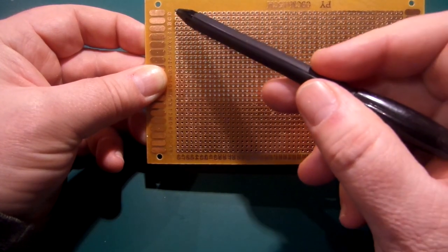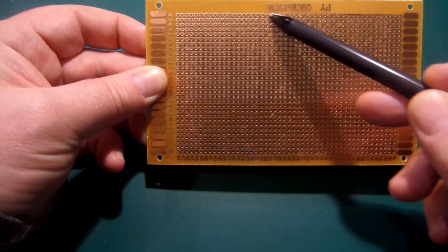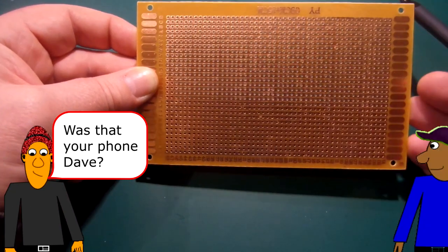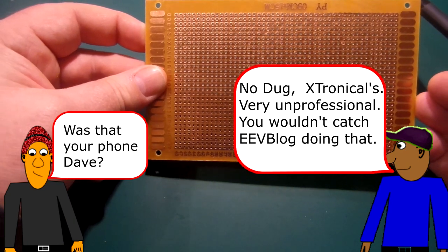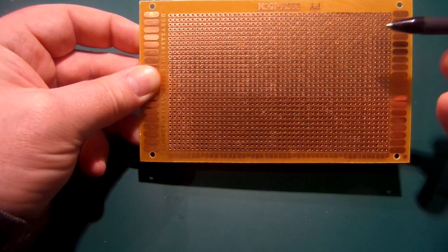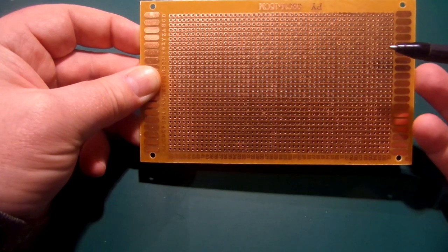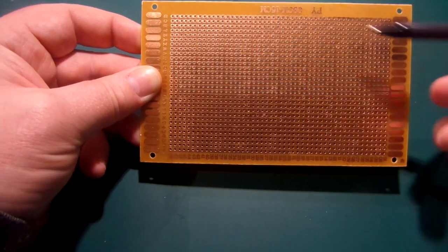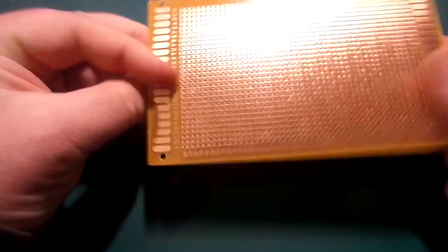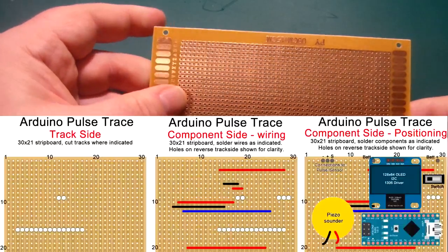I just prefer working with stripboard — this is what I started with back when I was almost a nipper, ordering it from Maplins, a UK distributor that actually went into liquidation earlier this year. With stripboard you don't have to add as many jumper wires, but you do have to cut some tracks in places. The design I have on screen is a piece of stripboard that is 30 across by 21 holes down.